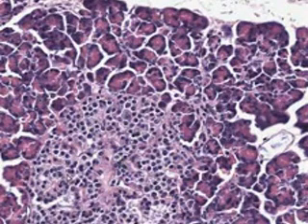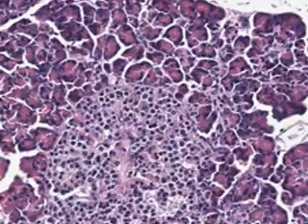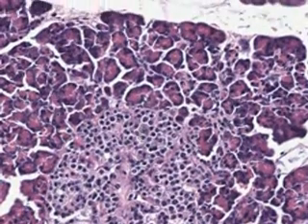You really cannot differentiate on regular H&E microscopy alpha cells from beta cells. So just call these islet cells. And like many endocrine cells, they have abundant cytoplasm, nice round nuclei, but not as prominent granules as you see in the zymogen granules of the exocrine portion of the pancreas like we have here.